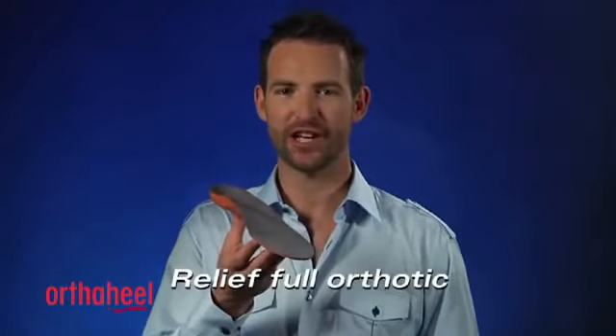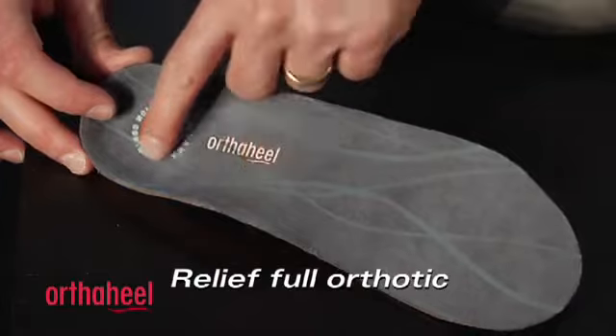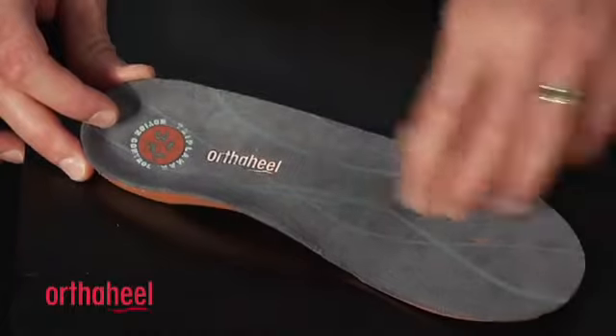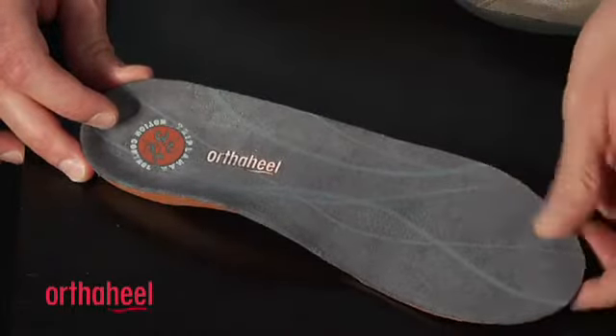G'day, I'm Steve from OrthoHeel and this is the Relief Full Length Orthotic. This orthotic has fantastic built-in arch support, a deep heel cup to help keep your heel in place and on that orthotic correction. They're flexible in the forefoot, and have a soft brush nylon top cover that's treated with EcoFresh to help reduce odour.